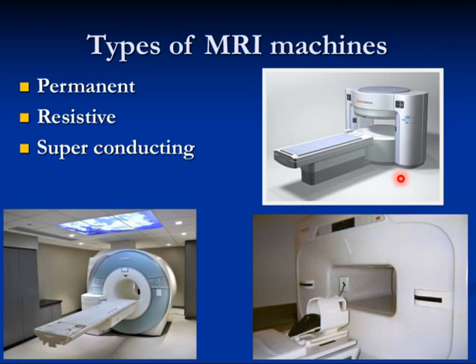But it is low power, first, and second, it's a very, very heavy machine. This machine weighs like 16, 17, 18 tons. And you cannot take it apart. You have to transfer it in one piece. Yani, 16 tons of metal transferred in one single piece. It is very, very difficult.